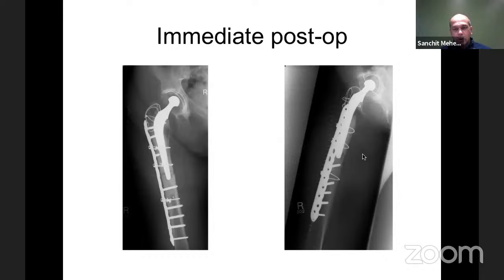However, this is the old sort of Dall-Miles type of plate. If you look at these x-rays, you would see that the distal fixation was never a problem. The tenuous fixation was proximal, and you only have 3 unicortical screws and 2 cables on that. The fracture site is not compressed. It's a single fixation device. There is no strut graft, no plate. There is still cement in the fracture site, which has not been cleared. So if I did this now, I would not be happy.